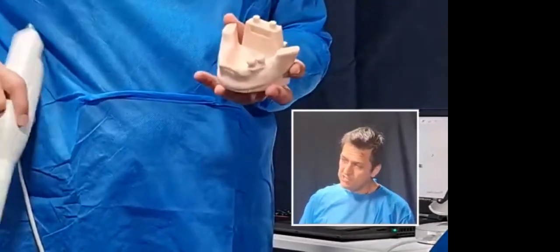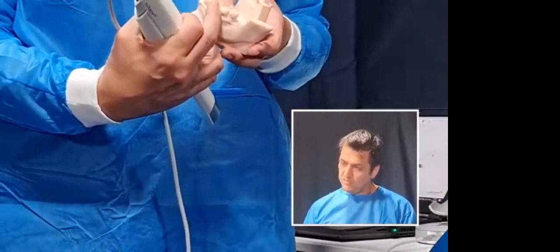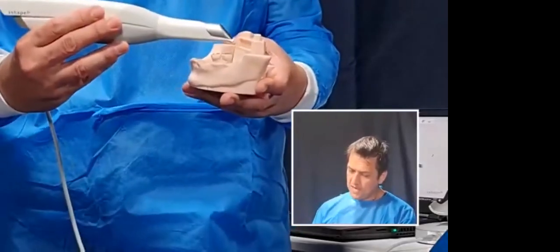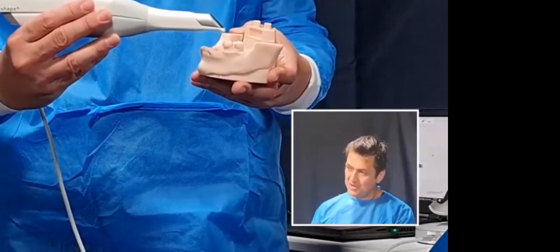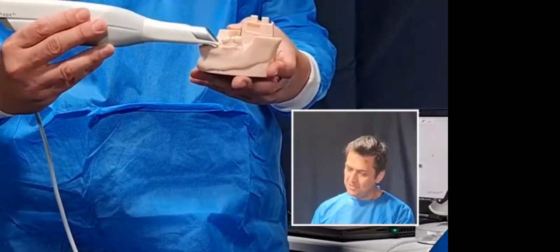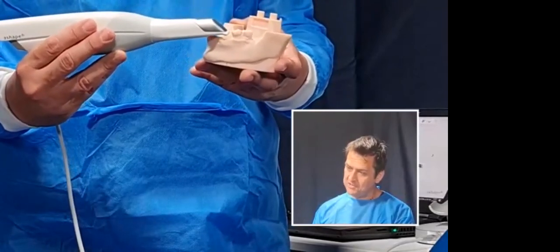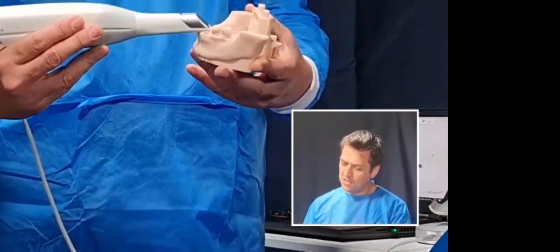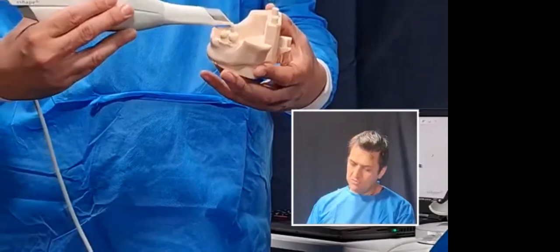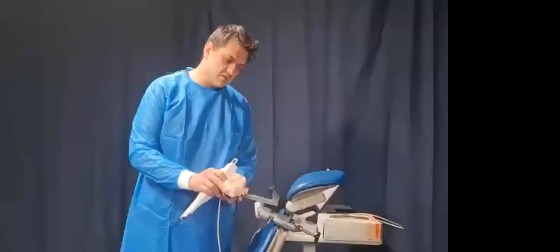Then the next thing I would do for this case is, there's a step here. You notice, and you find this a lot when you've only got one tooth, you're up here in the air scanning, but then you come down and now your scanner's not actually capturing anything because it's too far from the camera to the mucosa. So you've got to angle your way down to get down to the ground, so to speak. Then I come around like so, retracting with my fingers as I go, using my scanner.